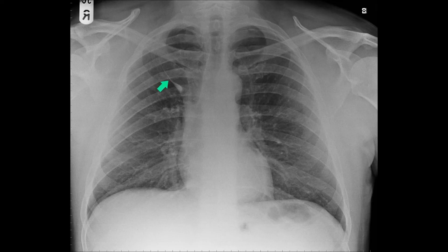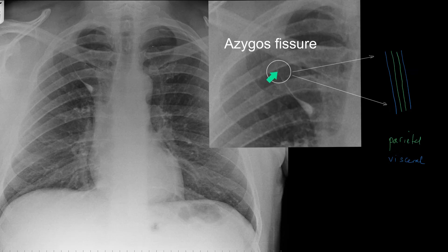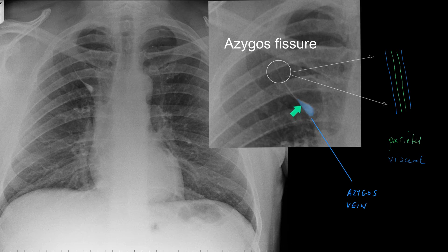Azygos lobe. Here is the azygos lobe on the chest radiograph. There is the azygos fissure. Here is the azygos lobe. And here is the azygos vein. It is said to occur in about 1% of normal chest radiographs. The composition of the azygos fissure is two parietal and two visceral pleural layers — so actually there are four pleural layers forming that fissure. At the bottom of the fissure is the azygos vein, which connects the azygos in a paravertebral position to the superior vena cava anteriorly.